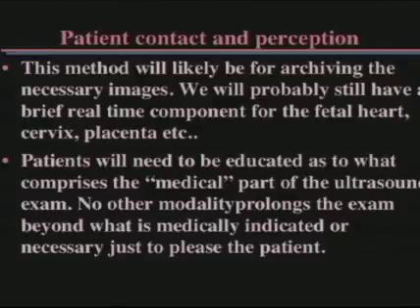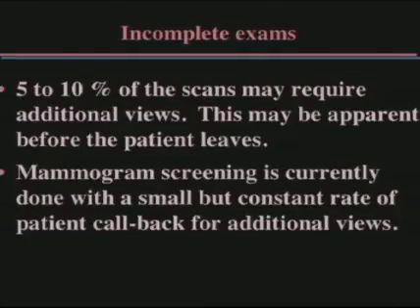No other modality prolongs the exam beyond what is medically indicated because it's very expensive to spend time on the ultrasound machine. About 5 to 10% of the exams may require additional views. It's mostly of the hands and the feet that may not be totally included within these volumes in some fetuses. But that should be apparent before the patient leaves, as we can review these volumes very quickly before the patient leaves. In mammography centers, the screening is often done without the physician on site, and there is a small number of patients that get a callback for additional views.